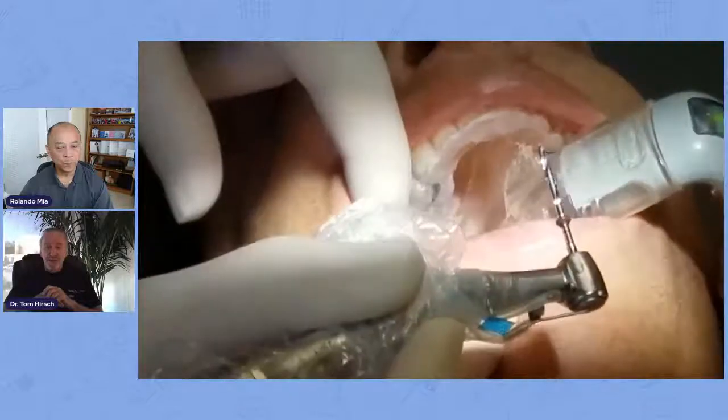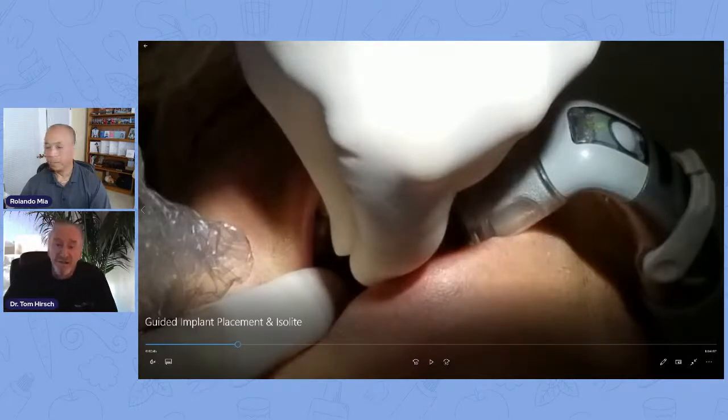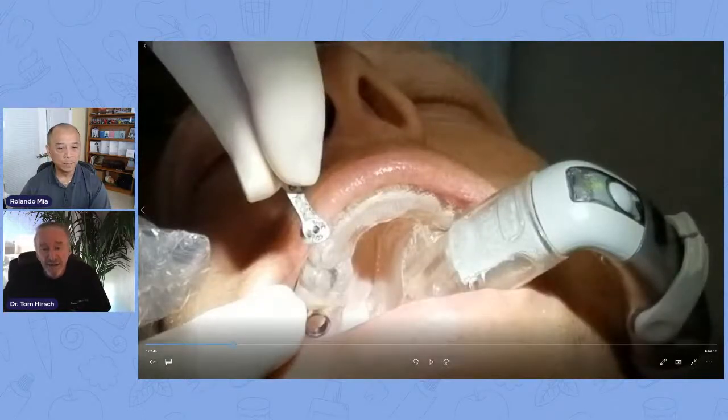So what we're doing today — that was a CCAT surgical guide that I used. The thing about using a surgical guide with the Isolite is, first of all, it takes all the muss and the fuss out of this whole procedure. You put the guide in, you put the Isolite in. What's nice is the Isolite will actually hold the surgical guide in place. I always use a complete full arch surgical guide — always, without exception — because I have stability and I don't have to worry. And sometimes if I see any movement at all, just a couple of degrees of movement on the osteotomy side will throw off the direction of the implant. With the Isolite in place, I know I've got great security. I know that any of these little tiny parts, if they happen to fall or come out, they're not going to go down the throat. And my assistant has two free hands to hand me all the stuff that I need.